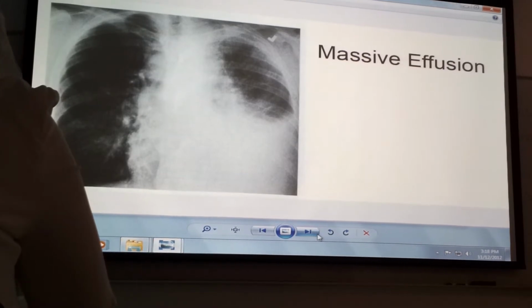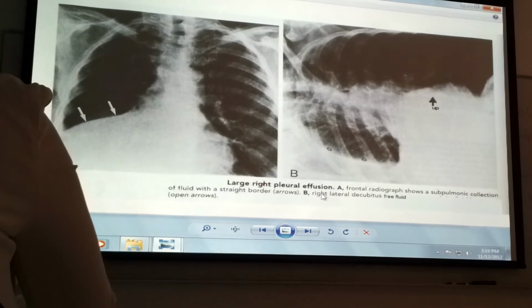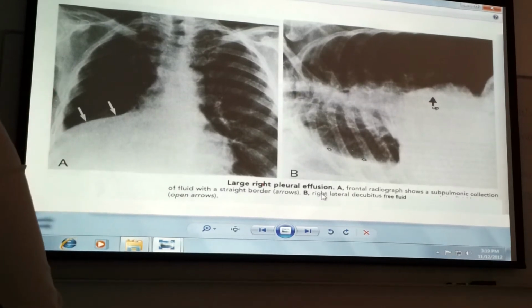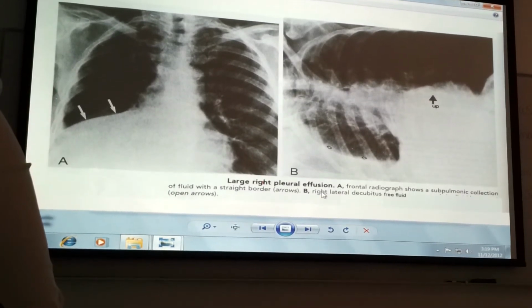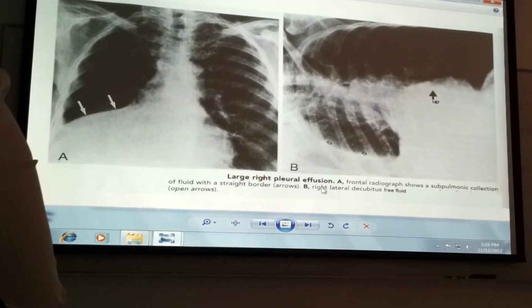Okay, so I just want you to recognize problems. Because you're going to get on the phone at 2, 3 o'clock in the morning, and the resident or the attending will say, listen, I got a patient here, we did a chest x-ray, the patient has shortness of breath, a fever, there's a white count. Oh, what do you see? I don't know. There's something there.